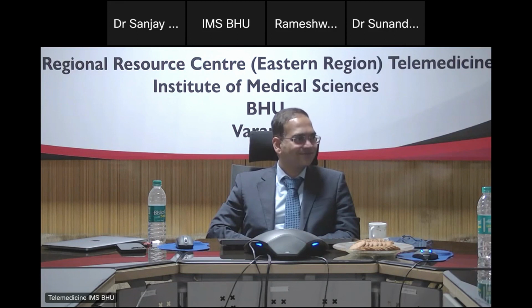So what you are terming as idiopathic may be tuberculosis, because we have seen multiple mycotic aneurysms. In your case, I think it was a staph or some bacterial infection, but in this case, it was proven to be tuberculosis. That was a rare case. We also published it. So that might be a little bit of concern for you in the future.